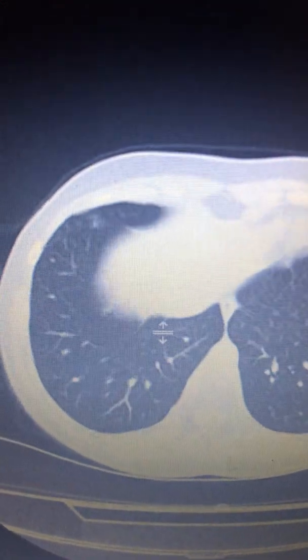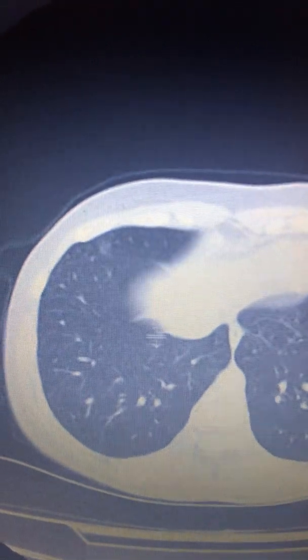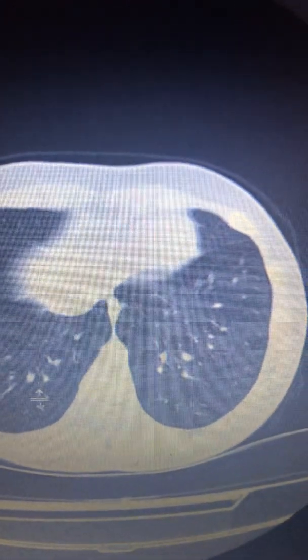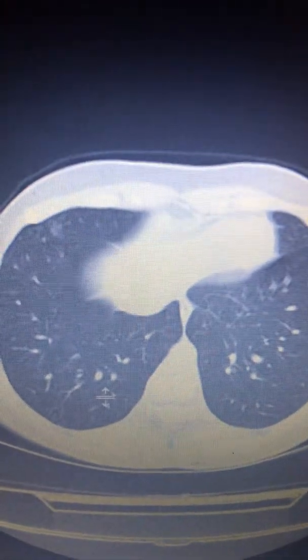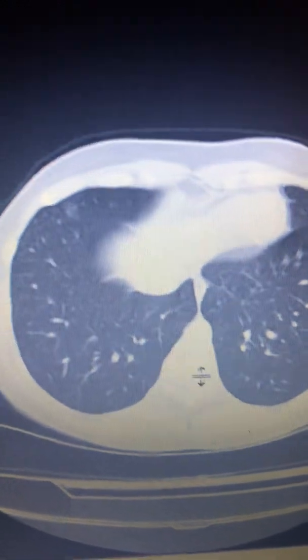Here we can see the liver tissue, but there's a very well hidden, small, tiny, knotty lesion here at the front side. This is the front side, this is the back side, and as we go on, we just realize a small, tiny thing here. Spherical. Think of it as a small grape collected there.